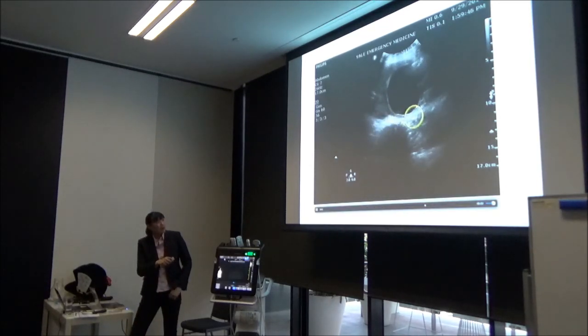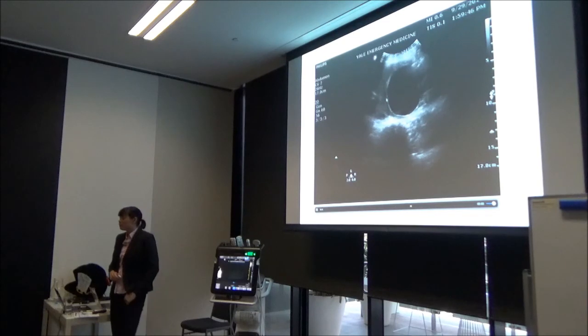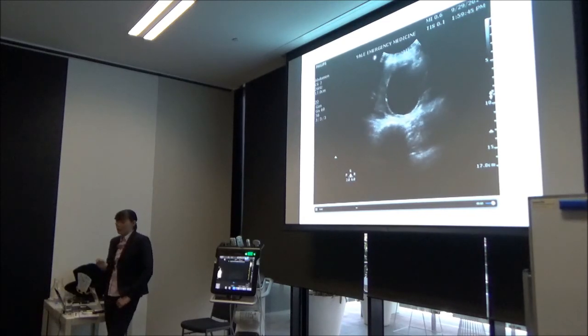So here's my spine, here's my huge aorta. This aorta has ruptured. When I have an aorta rupture, should I get a positive FAST exam? How come? So the aorta is retroperitoneal. However, if you lose enough blood, it can spill over into the intraperitoneum. That is a bad sign, and that is a harbinger of death here.